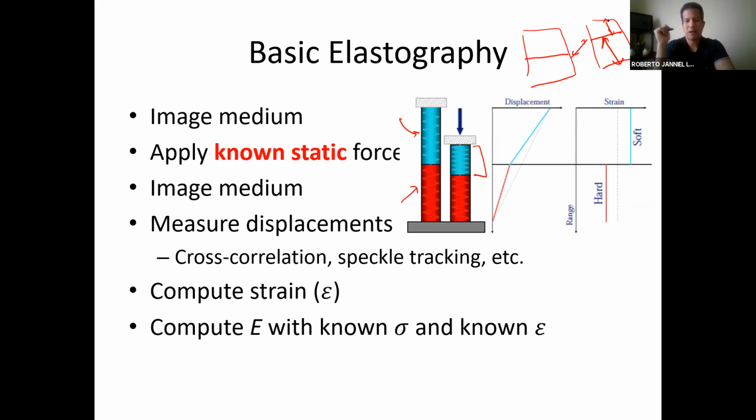But when you really think about it, this would have practical limitations if we were to look at the boundaries in between the two. It would involve tracking boundaries and things like that, and that's not the way that you do it. In practice, what you do is track the changes at every depth. You don't go for the interface and say, well, the first medium compressed this much. Pixel by pixel in the image, you track how much things moved.